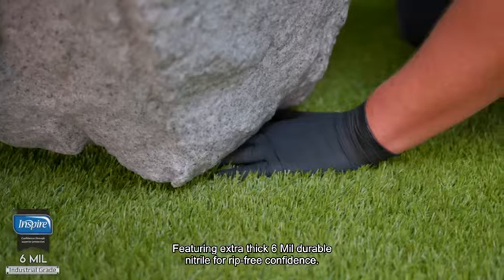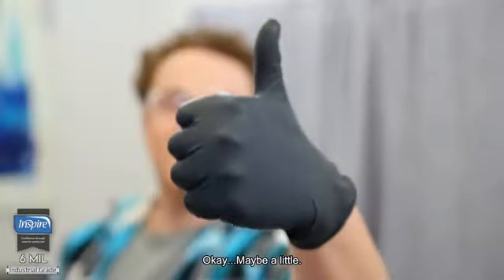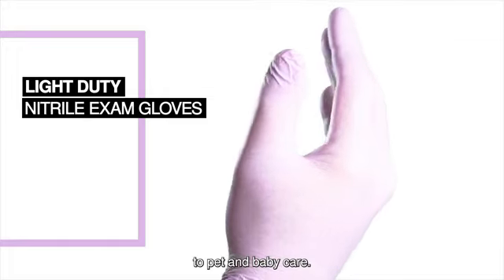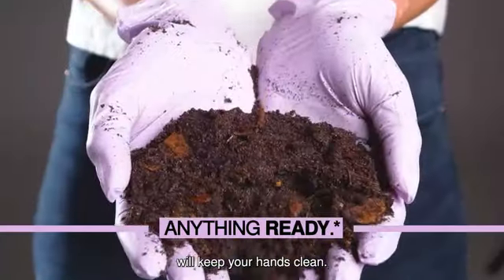The glove's nitrile fabric type ensures durability and flexibility, allowing for comfortable wear during extended periods of use. The material also provides excellent resistance to punctures and tears, offering reliable protection for both the wearer and the patient.